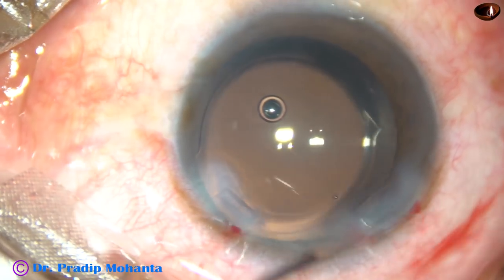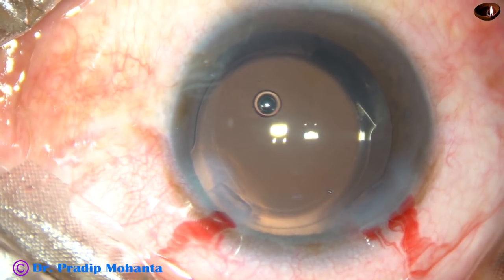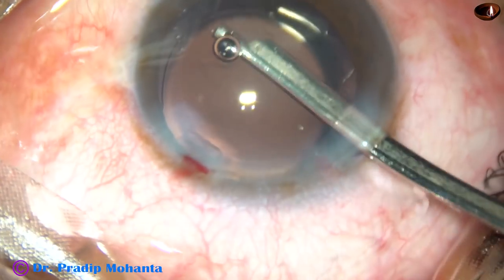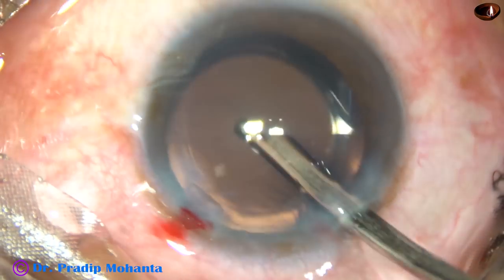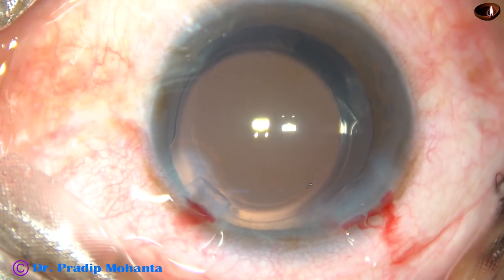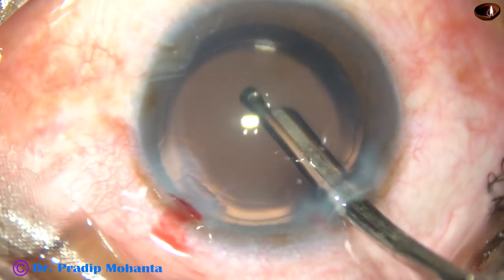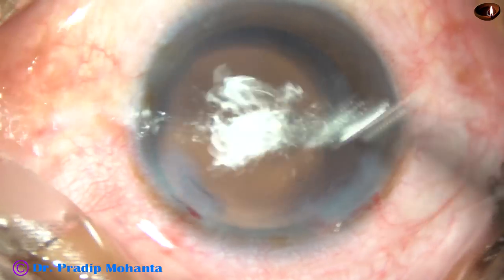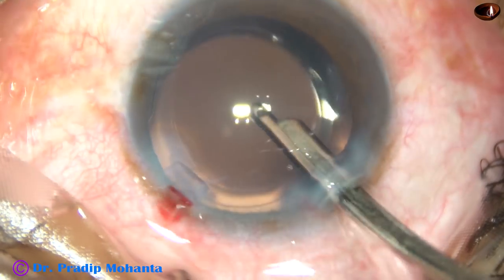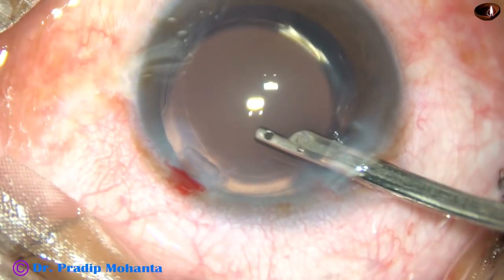So, this rhexis is about 5.5 to 5.75 millimeters. Now, this is the final lavage of the anterior chamber. At this time, whatever viscoelastic substance sticks to the corneal endothelium comes out. A very gentle stream of fluid is directed towards the corneal endothelium, and irrigation and aspiration are working together.